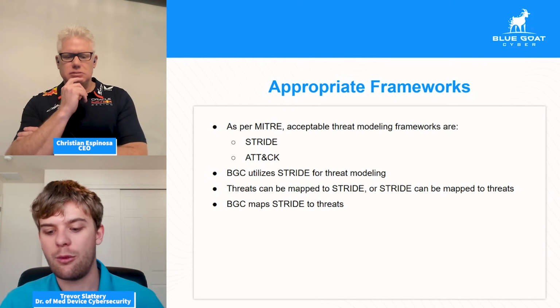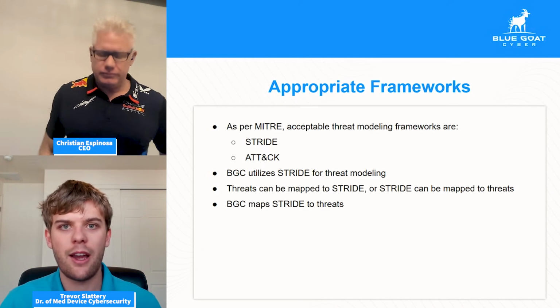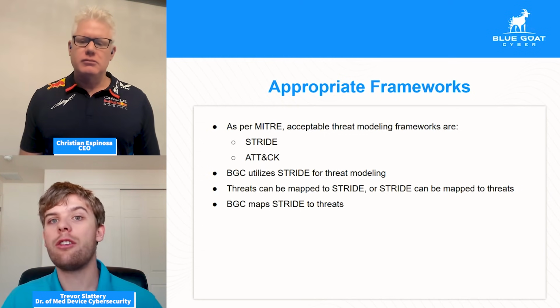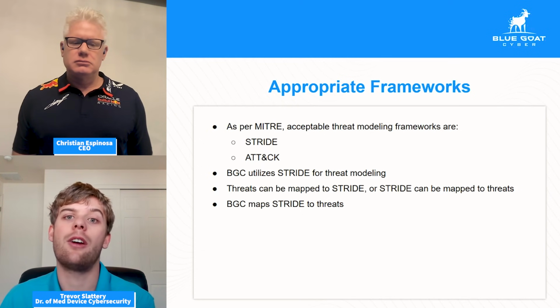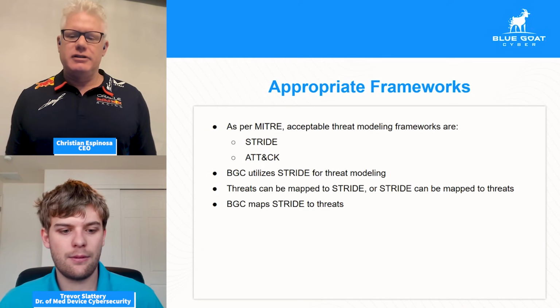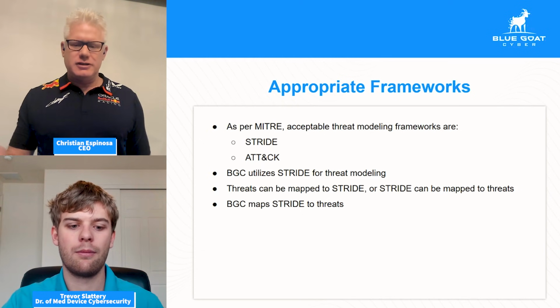The alternative is we can take these threat categories out of STRIDE, so information disclosure, and think of anything that can happen to the device that would cause information disclosure, list them all under there. This also, in that case where we have database credential theft, that would apply to the same area under elevation of privilege. Yeah, so STRIDE is a mnemonic, right? And so it's spoofing, tampering, repudiation, information disclosure, denial of service, and elevation of privilege.